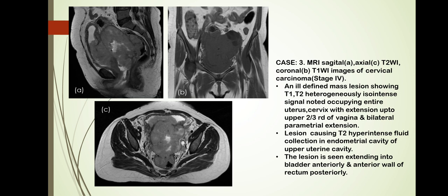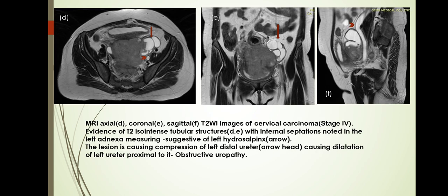This is the third case, staged under stage 4. Images A and C are the sagittal and axial T2-weighted images, and B is the coronal T1-weighted image, showing an ill-defined mass lesion with T1-T2 heterogeneously iso-intense signal, occupying the entire uterus and cervix with extension up to the upper two-thirds of vagina and bilateral parametrial extension. The lesion is causing T2 hyper-intense fluid collection in the endometrial cavity, and extends into the bladder anteriorly and anterior wall of the rectum posteriorly. Images D (axial), E (coronal), and F (sagittal) show T2 iso-intense tubular structures with internal septations in the left adnexa, measuring consistent with left hydrosalpinx (shown with arrow).